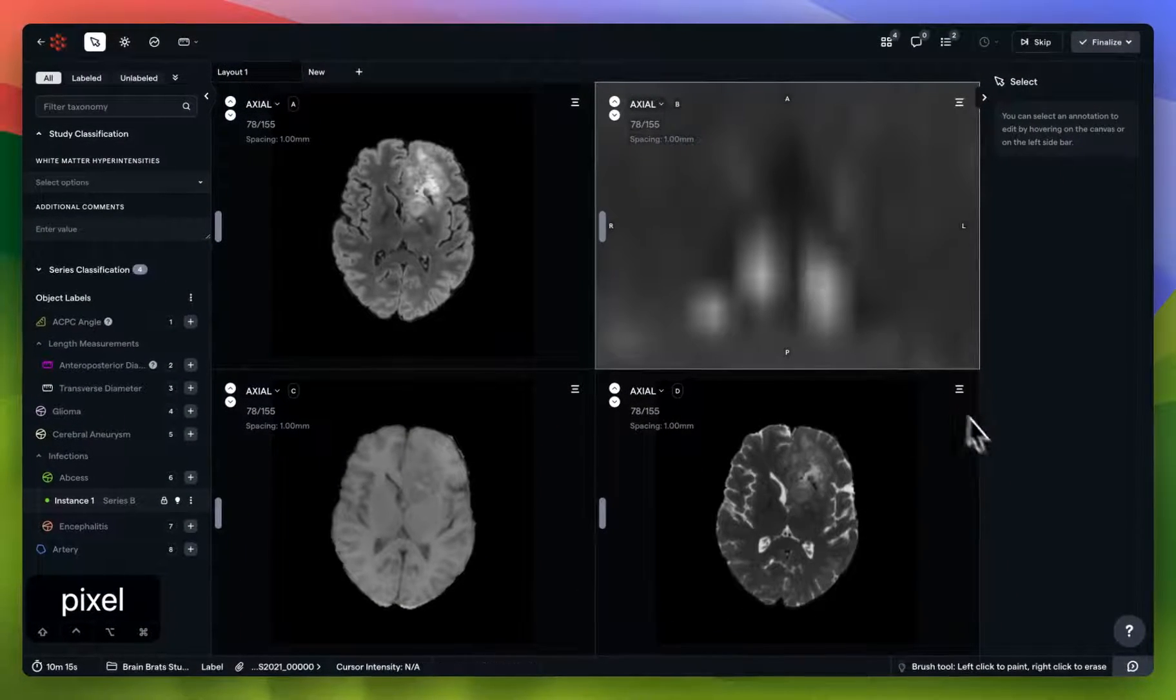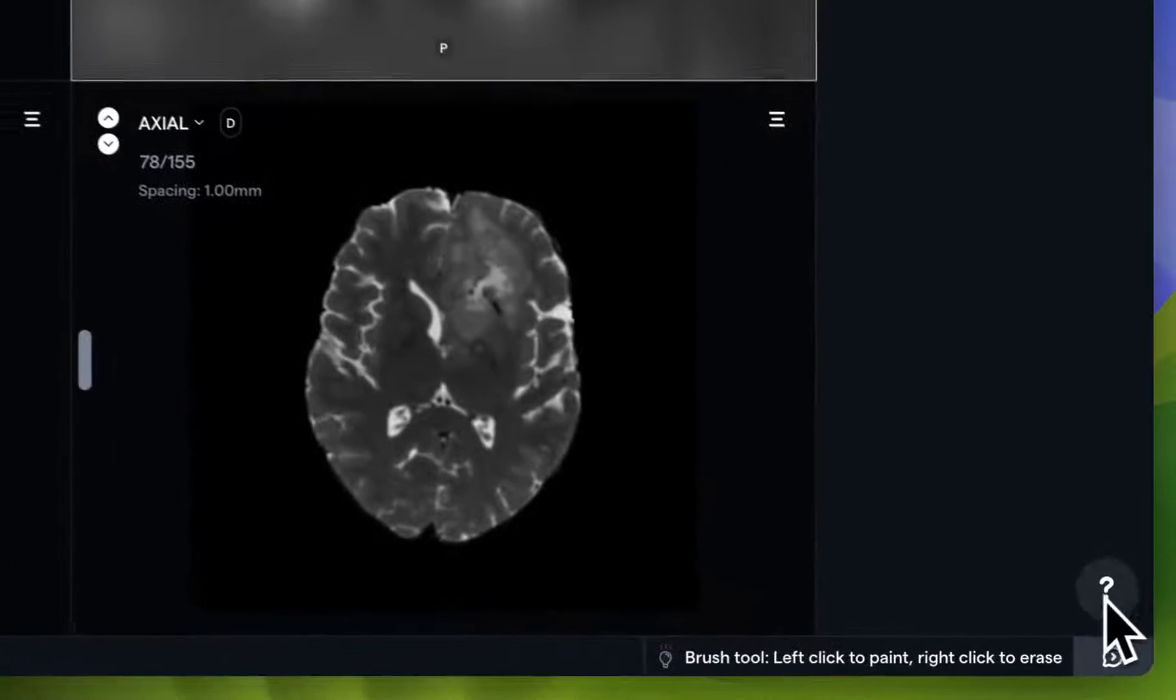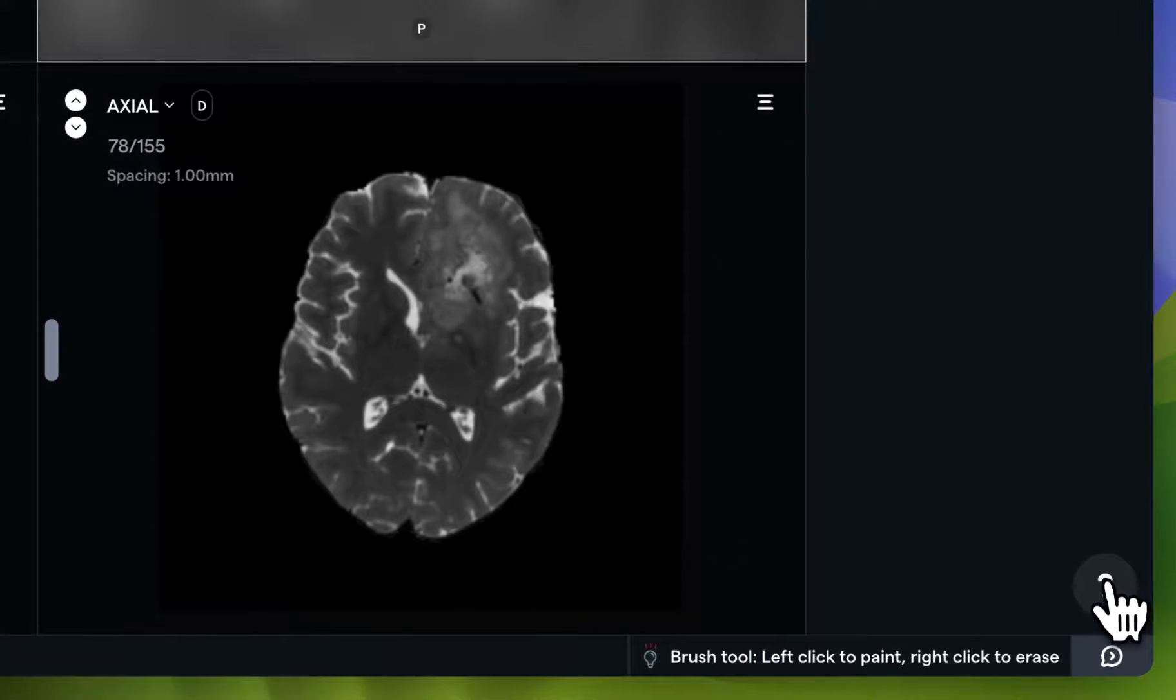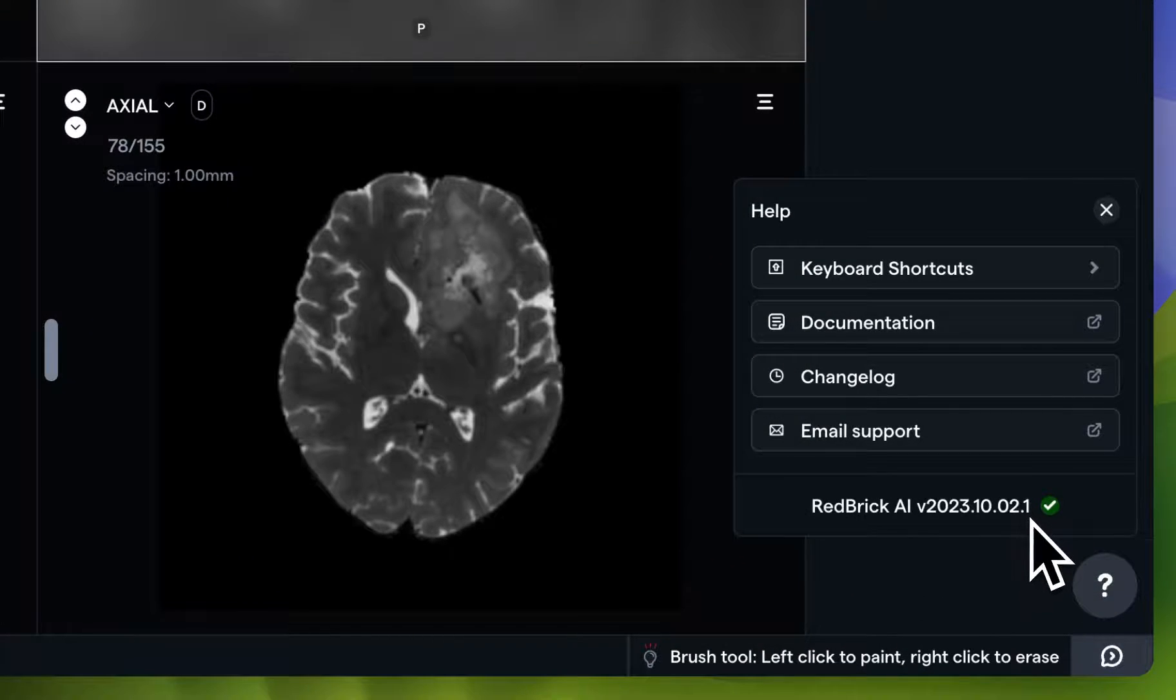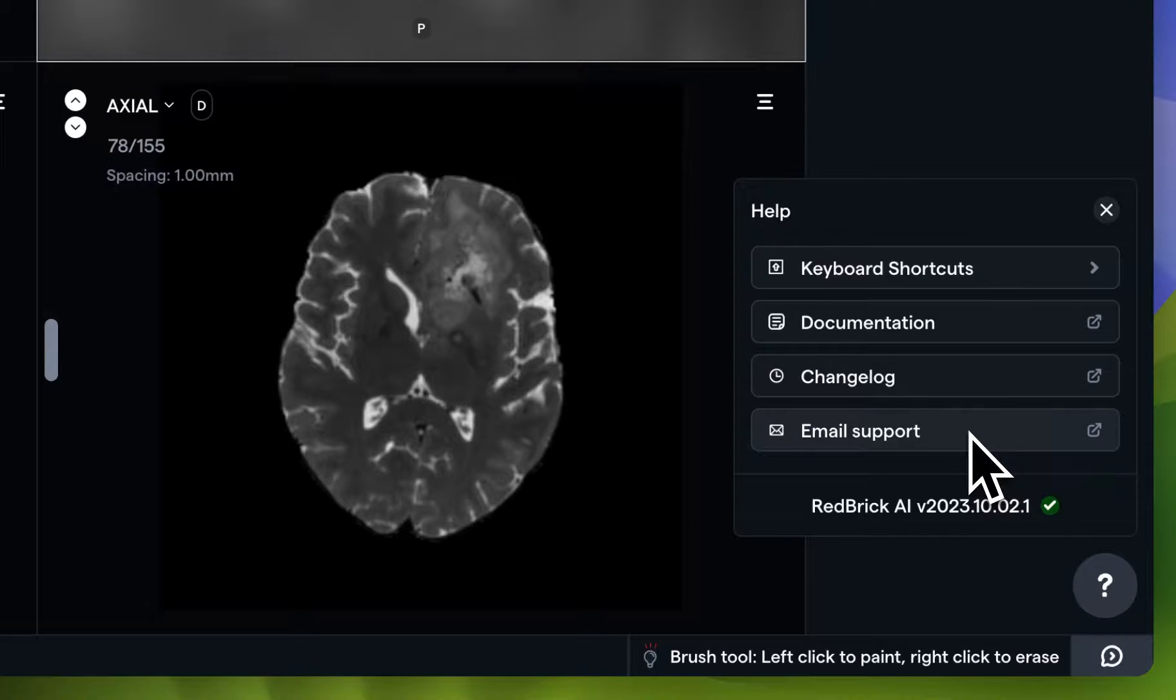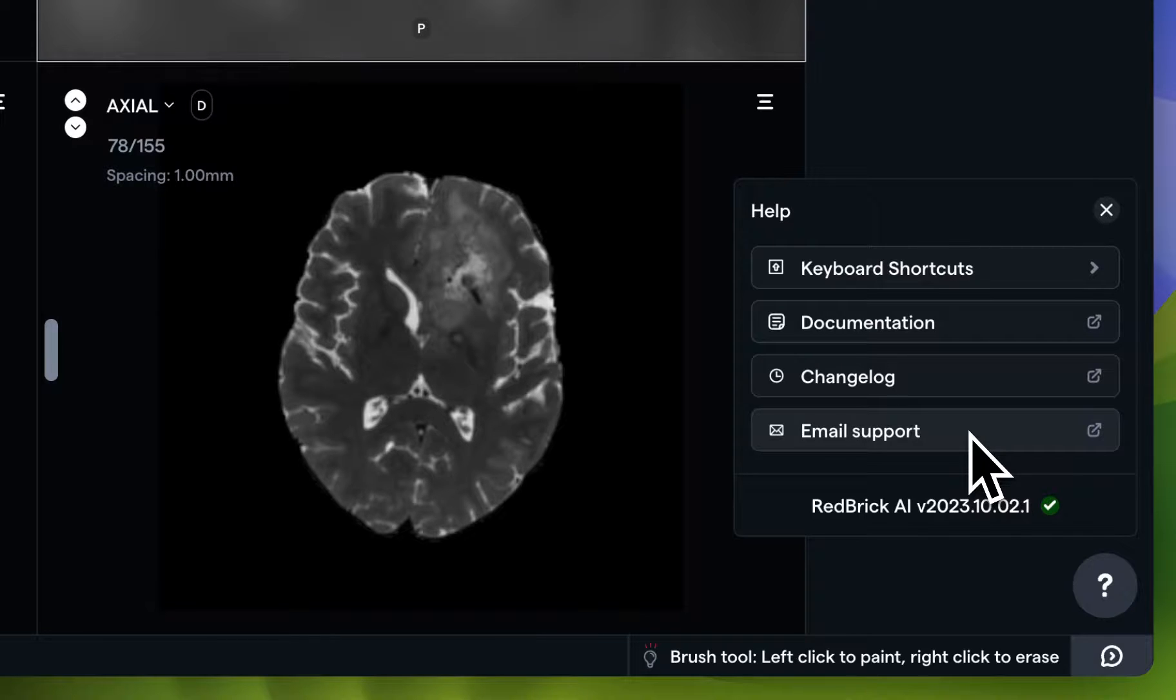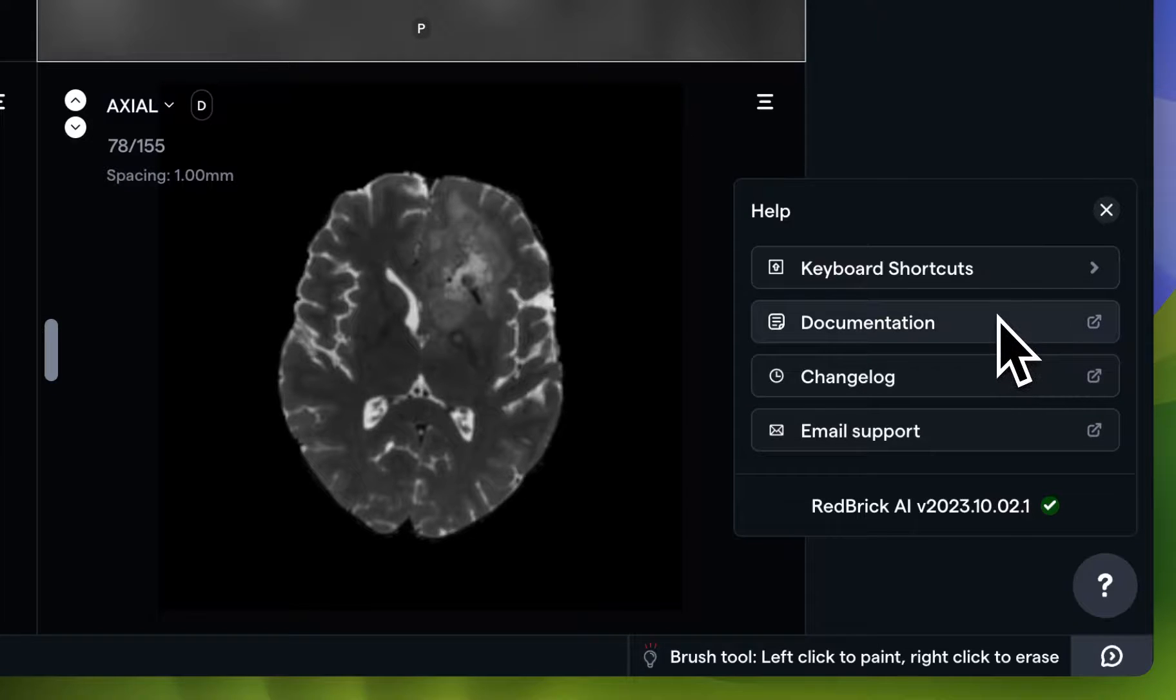The bottom right-hand part of the display also contains the Help button, which you can use to check your current version, email our support team, and please do email us if you have any questions, concerns, or have any general clarifications about our annotation tool or any other part of the UI.